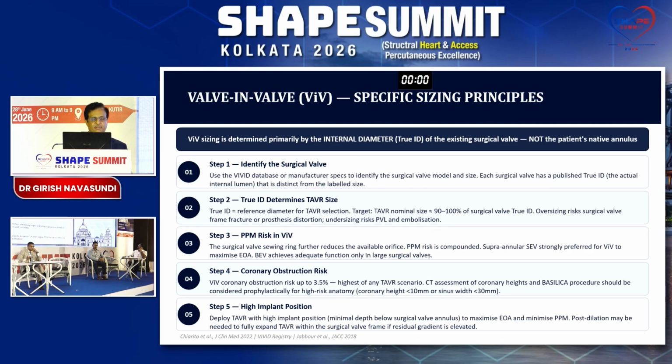Coming to valve in valve, I think you all discussed. One single thing I would like to tell you: please identify the surgical valve. It's very, very important. The true ID of that previous surgical valve is your starting point, not the valve size written on the discharge summary. Go to the website, look at the internal diameter of that particular surgical valve and start from there. And if the second one is true ID, you've already got it. And TAVR nominal size should be 90 to 100% of the surgical valve true ID.